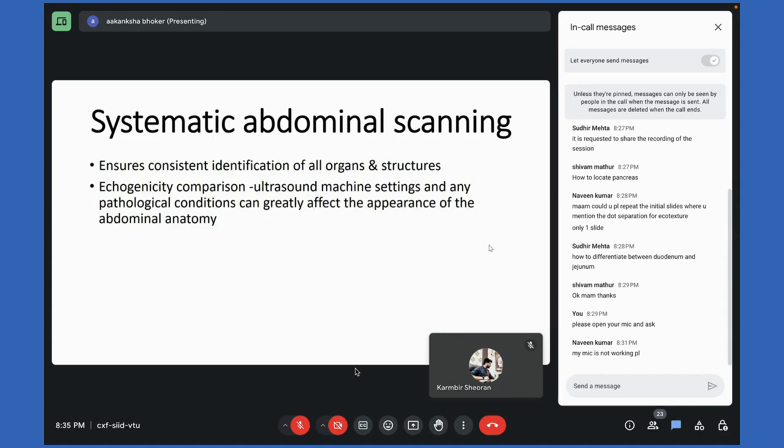In human machines, we can simply use some Excel sheets where we put the pre-available formulas, and from that we can calculate. So definitely, human machines are as good as veterinary, and in fact human ultrasound is a technique which is much more advanced, so their machines are much better as compared to veterinary. See, I told you, a machine is only as good as the sonologist. This is one thing also, how much you will optimize.